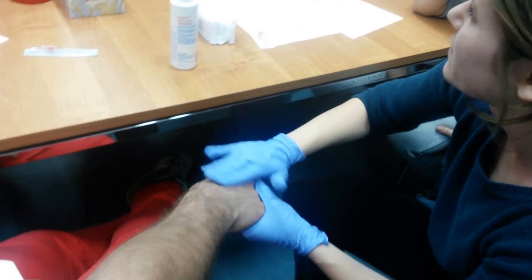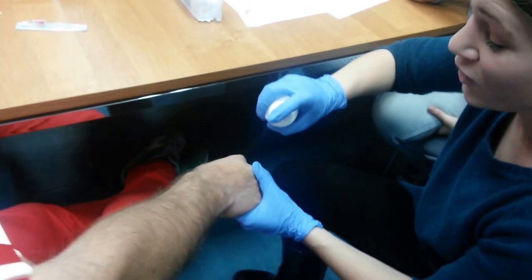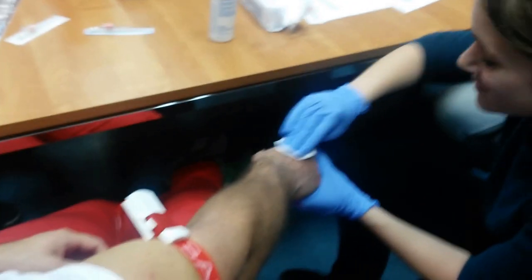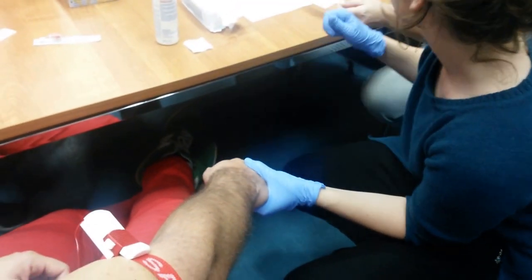Avoid that artery because then you can have a much bigger bleeding. Sometimes when you can't see the vein, it's also good to give it a bit of a rub or a pat. His arm is going purple — I completely forgot, you shouldn't keep the tourniquet on while you're doing all the looking around. His arm is probably going to die — infarct. I'm hoping it won't.